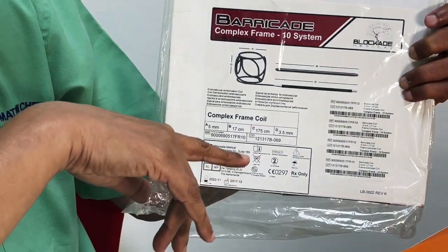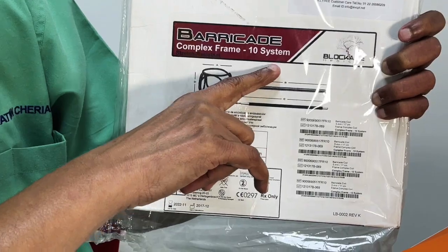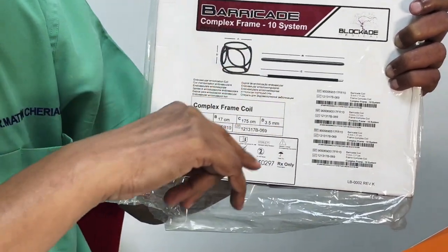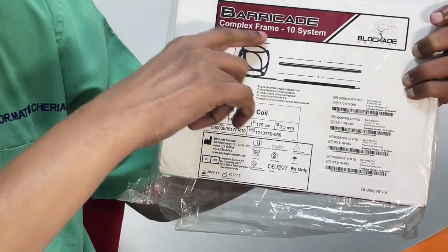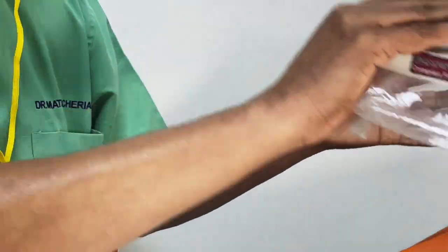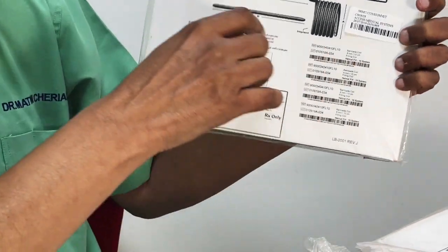This is another company. It comes from Balt today. It's called Barricade. This is also a complex frame system, and you can use it. Basically, all of them after that follow the same pattern. You will have a diameter of 5 millimeters, a length of 17 cm, and you know that you can just use it. And this is a complex framing system, so use it as the first coil and the second coil. For example, this is from Balt, Barricade.